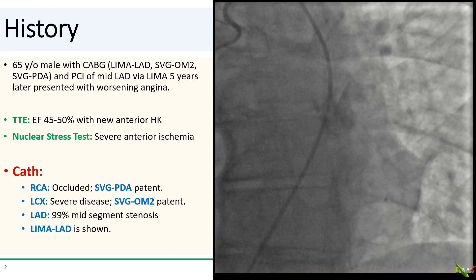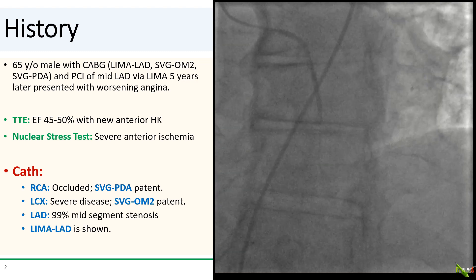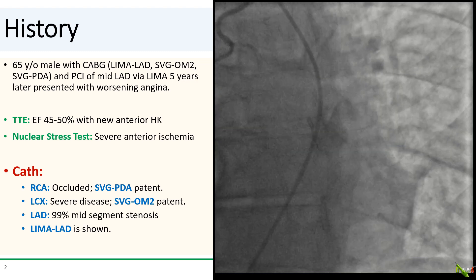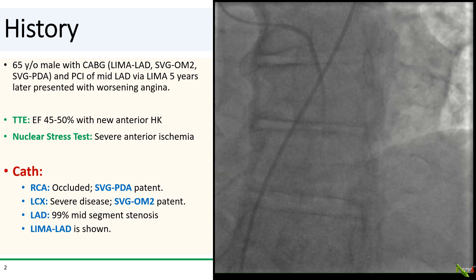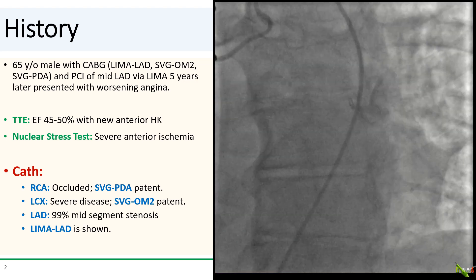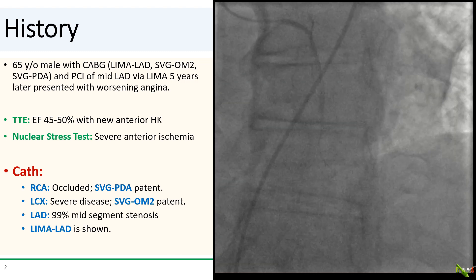The patient is a 65-year-old man with a history of CABG. He had a LIMA to the LAD, a vein graft to OM2, and a vein graft to the PDA. Five years after his CABG, he also underwent PCI of the mid-LAD via his LIMA. He presented with worsening exertional angina. Echo showed mild LV dysfunction with new anterior wall hypokinesis, and a nuclear stress test showed severe anterior ischemia.